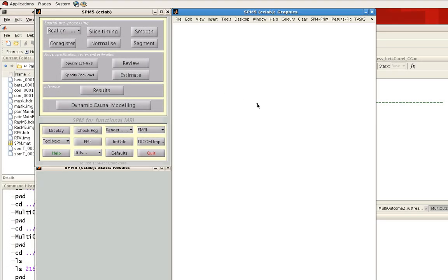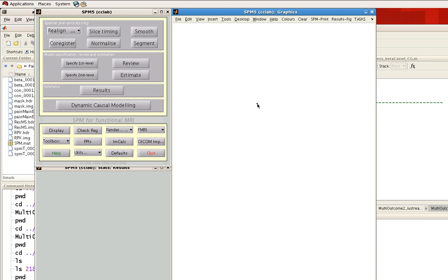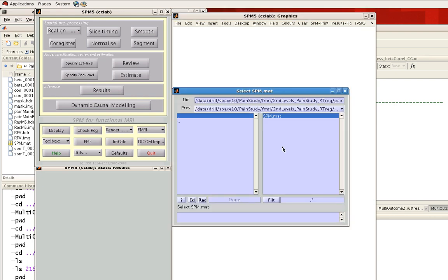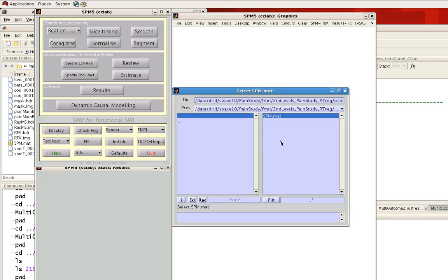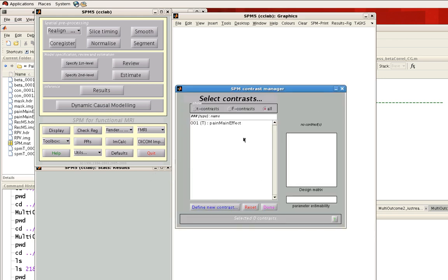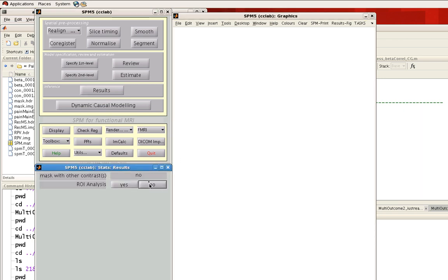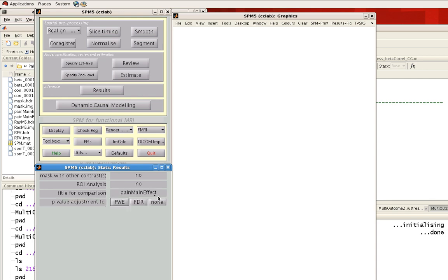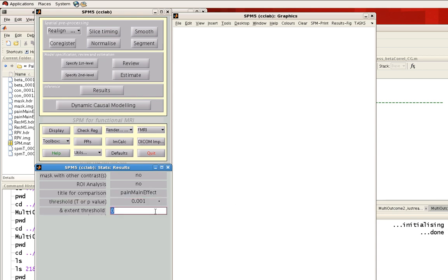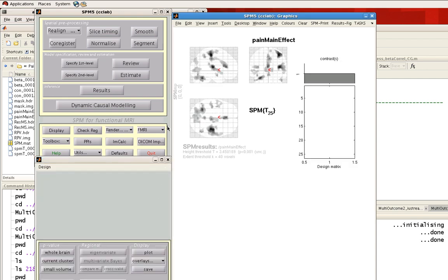Here I'm going to load up results which simply look at the main effect of a painful shock delivered to the left hand. I'm going to use a relatively conservative threshold. The first thing you see is this glass brain where you can see three orthogonal views through the coronal, sagittal, and horizontal sections of the brain.